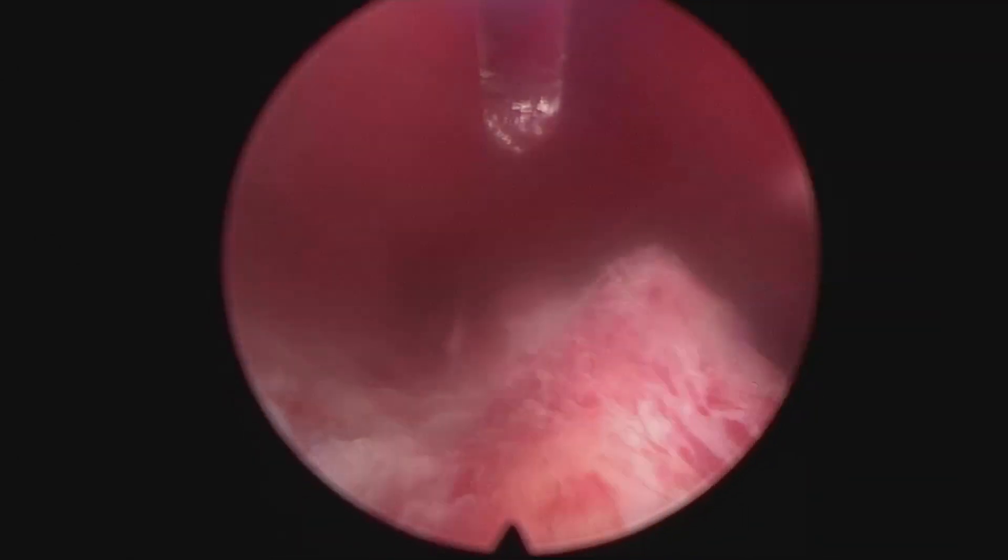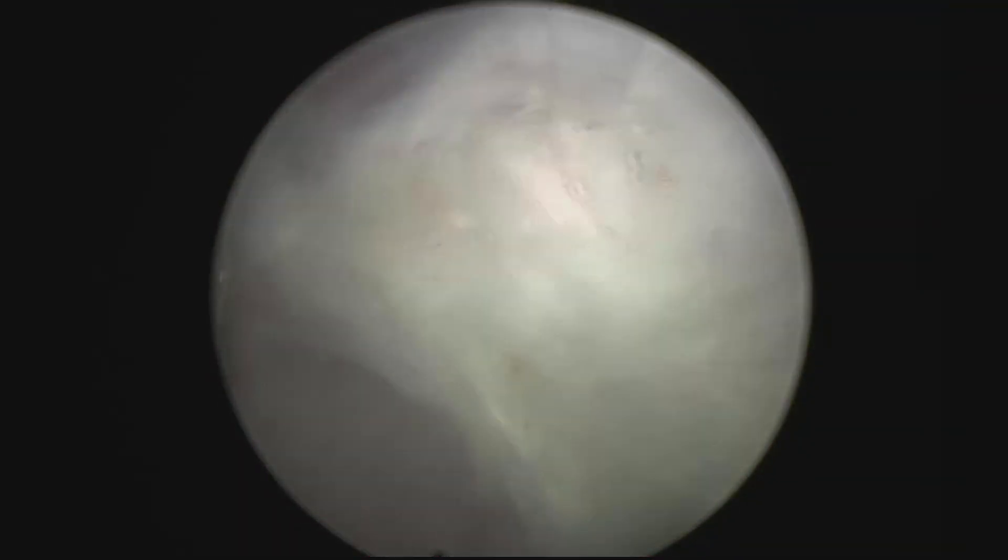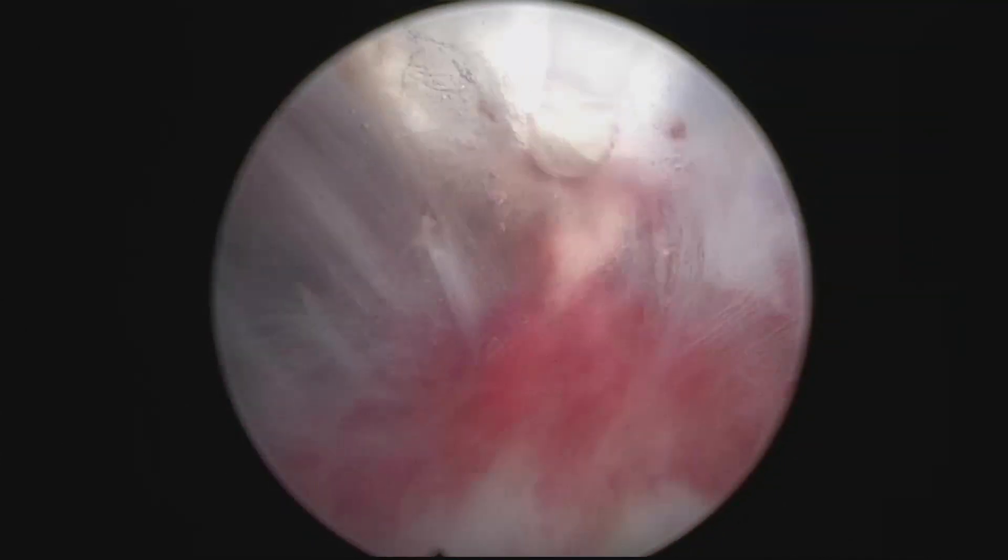Now you see that the procedure is going to be a piece of cake and extremely fast because we are dissecting this line of attack. Look at the sphincter — how beautiful. The whole mucosa has been preserved. As you can see now, the idea is that we can follow all around. We have a line of attack that goes around, and you just have to follow this line. Instead of going very deep in a very small area, what I try to do is to follow this wide line that orients you very well and tells you where you are. The fiber is always kept at 12 o'clock.